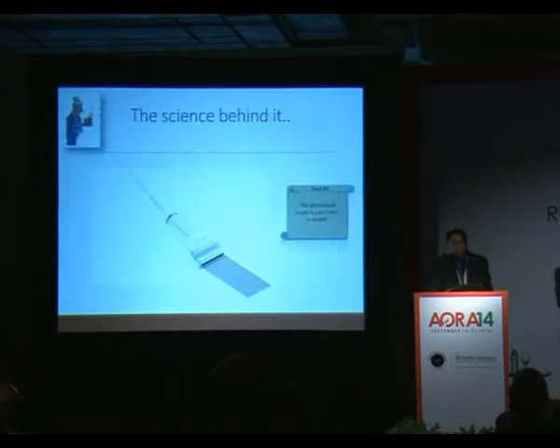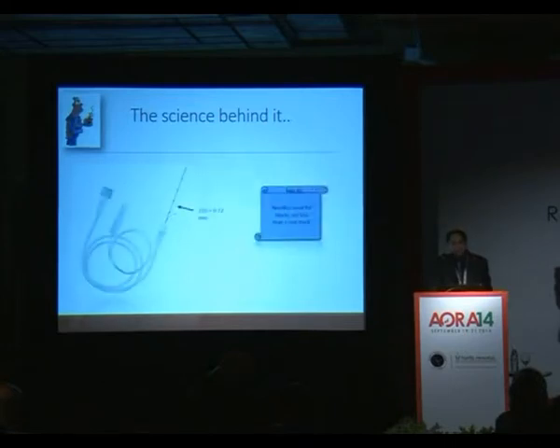Just a few concepts for you to know if you are new to ultrasound. Remember that even though the probe is big and fat, the ultrasound beam that comes out is just 1 millimeter thick. And your needle is less than 1 millimeter thick. And the whole skill here is trying to align these two together under 2, 3, 4 centimeters of tissue.